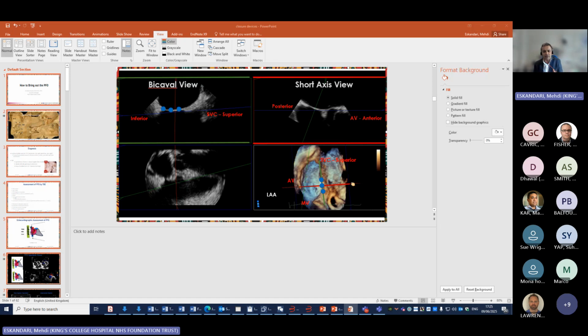So in summary, where you choose to puncture, from superior to mid to inferior, if the fossa allows, gives you the trajectory, and a posterior puncture gives you the distance from the mitral valve. So almost always with any procedure, you puncture posterior because you need enough distance from the mitral valve or LA appendage, and then depending on what you want to do, you puncture superior, mid, or inferior.